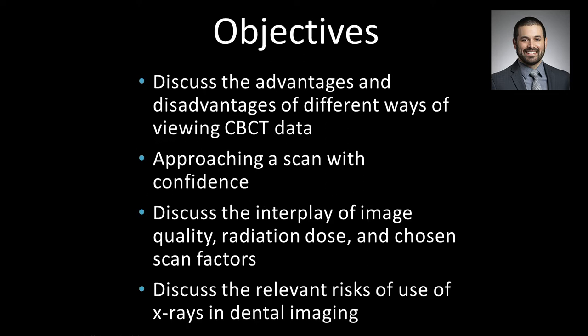We also talked about approaching any scan with confidence. If you're just getting started, or a patient walks in with that scan in their hand, plug it into your computer and go. You're not going to hurt anything. Look for your reference lines, look for the right and left markers, and start to scroll and look for a way to reconstruct the pan to work your way through the teeth.